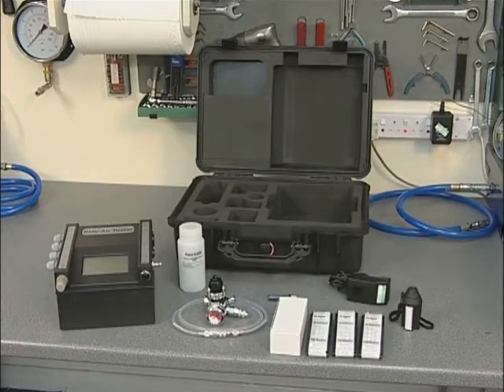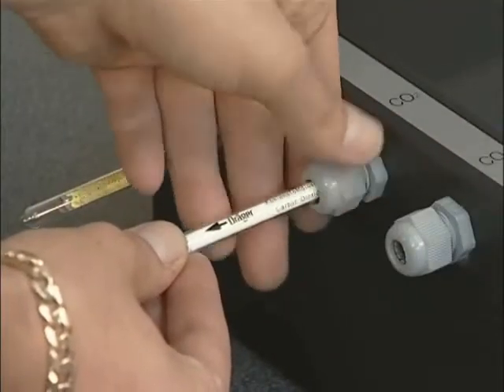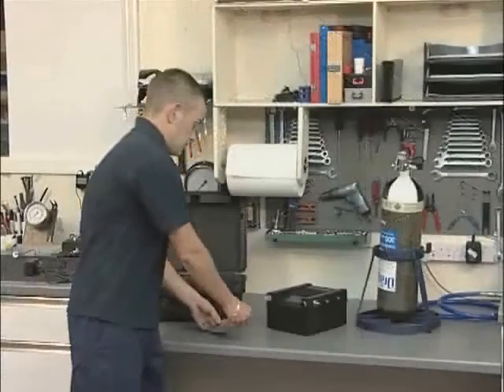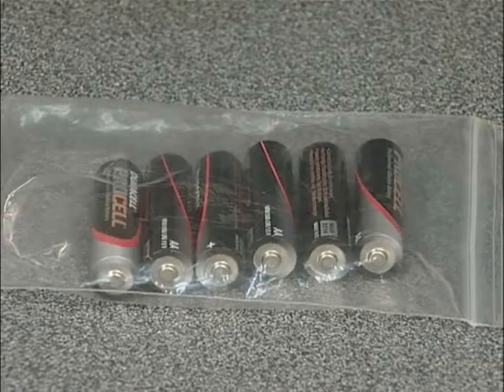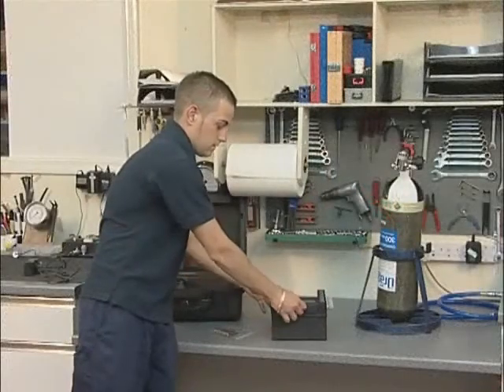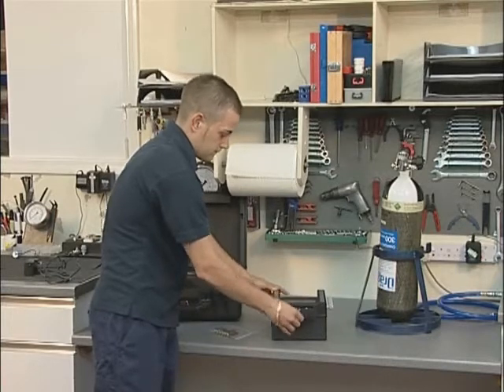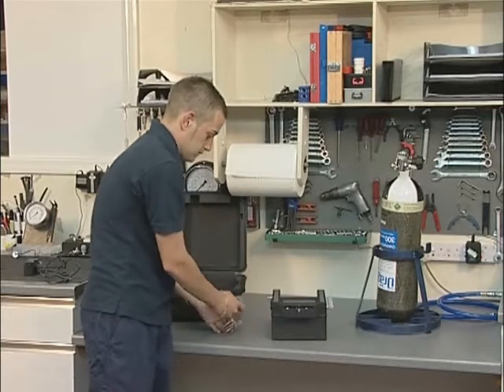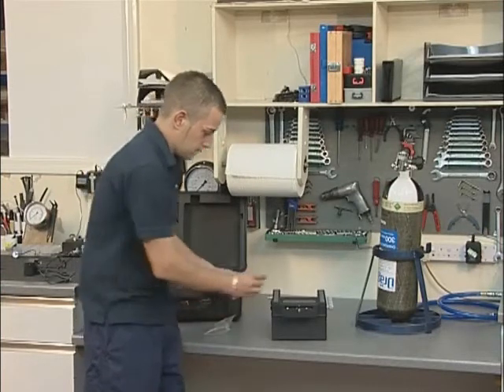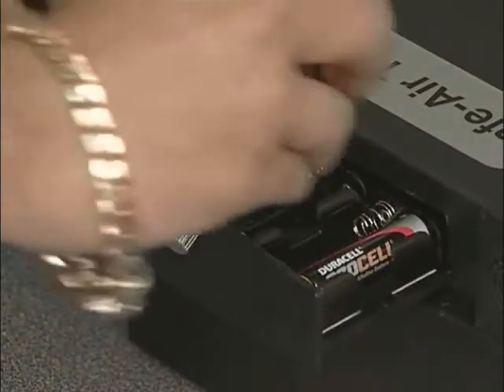It is primarily designed to be used from within the case; however, the tester can also be removed and operated separately where space is at a premium. Testers are supplied with batteries packed separately. Please note that rechargeable batteries are not suitable for use with this instrument. These must be installed prior to use, and it is important to strictly observe polarity when fitting batteries and ensure that they are correctly located.